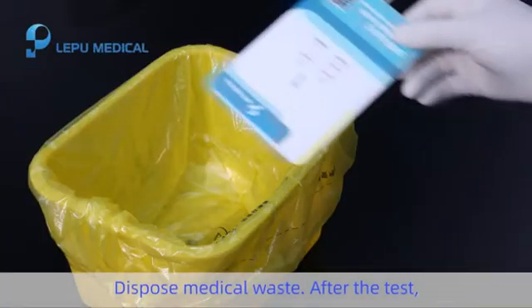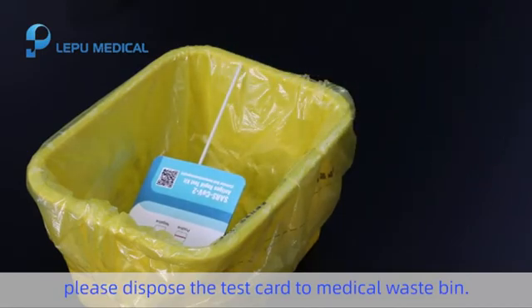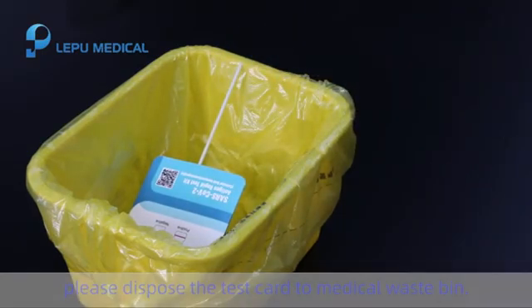Step 6: Dispose of medical waste. After the test, please dispose of the test card in a medical waste bin.